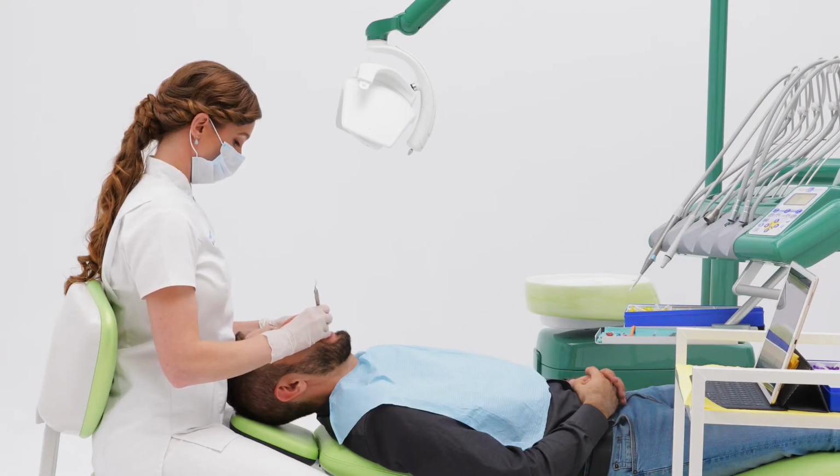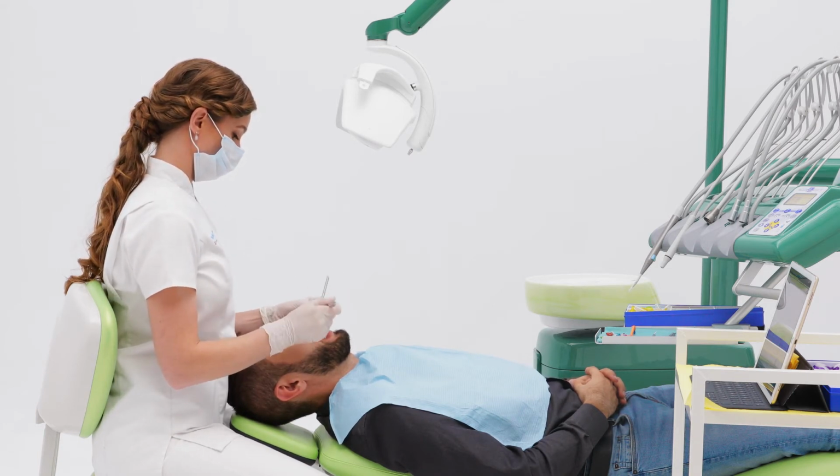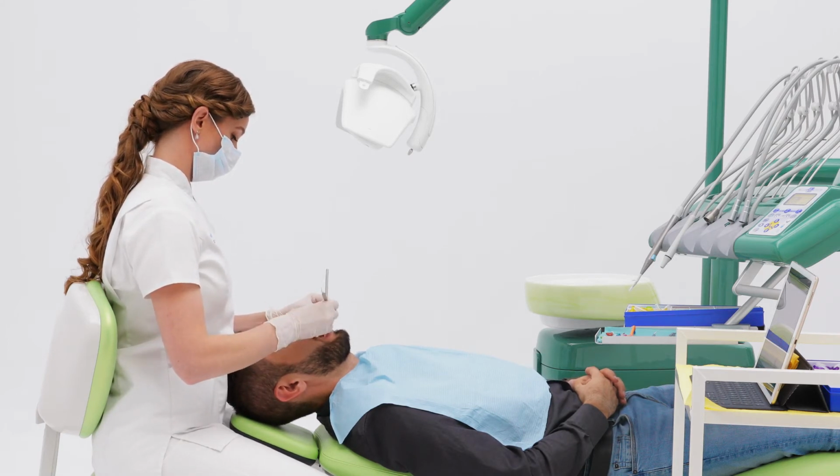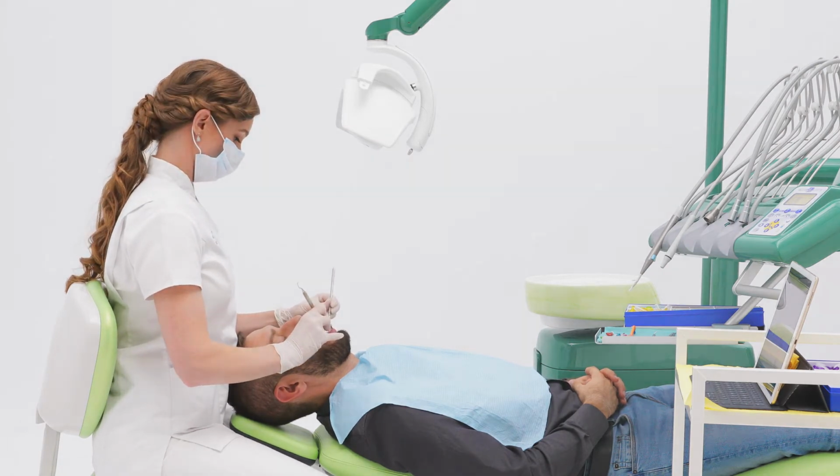It is now time to complete the patient's dental treatment. In my case here, I will complete my treatment with the dental hygiene cleaning, as the patient is already in the correct supine position. After his dental cleaning, I will then complete his review and coach.